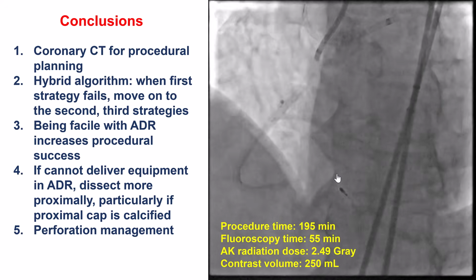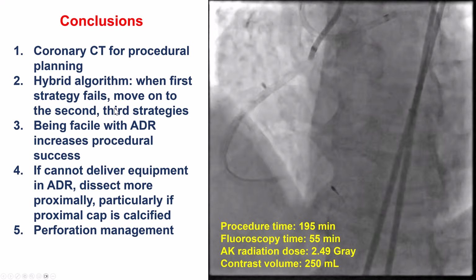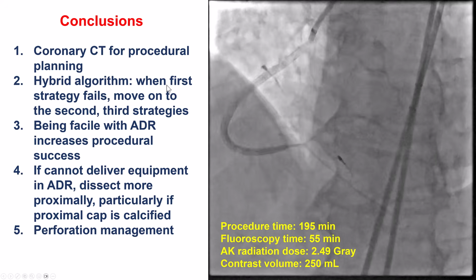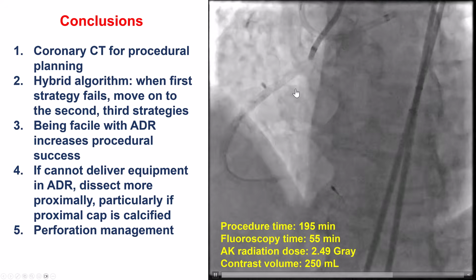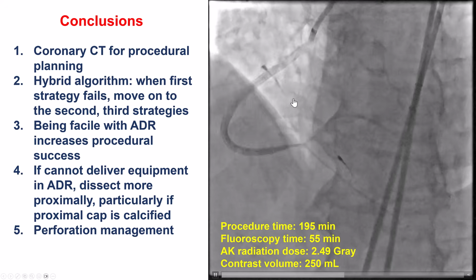So multiple lessons from this case. The first one is that coronary CT can provide valuable information for planning CTO PCI. In this case, it alerted us to the presence of a heavily calcific proximal cap, which did create multiple issues and eventually was overcome by using the side-base technique.